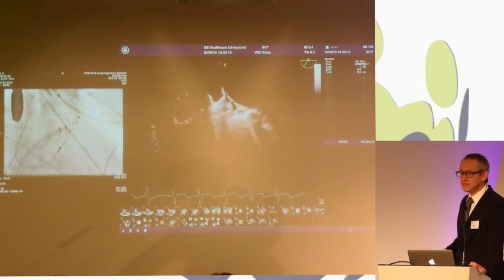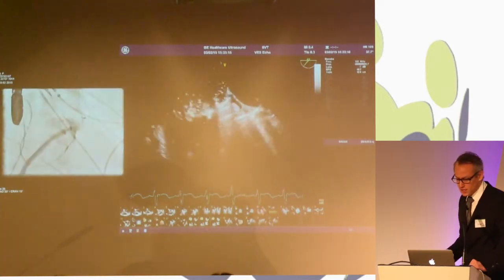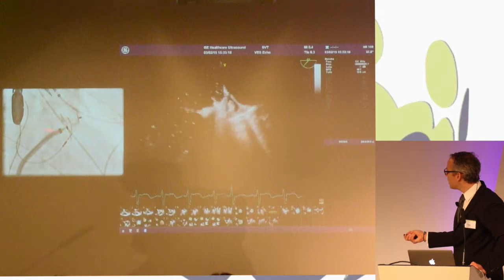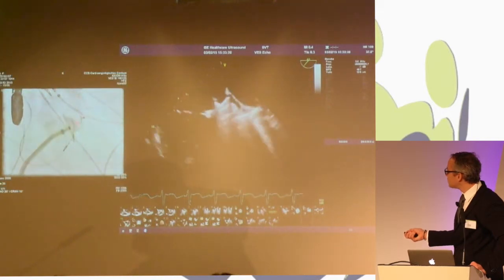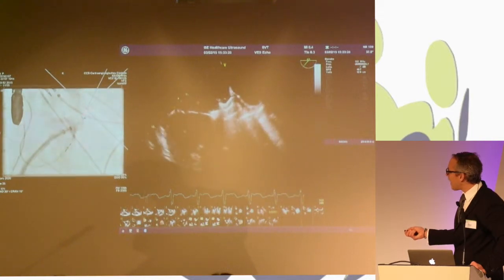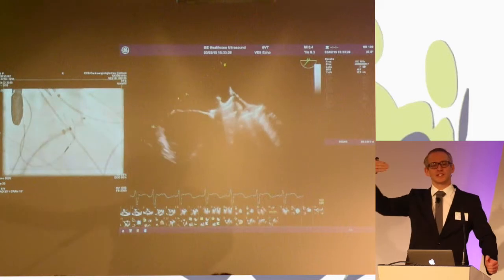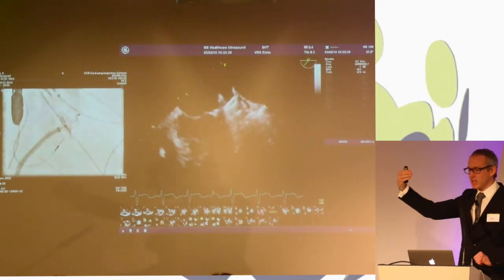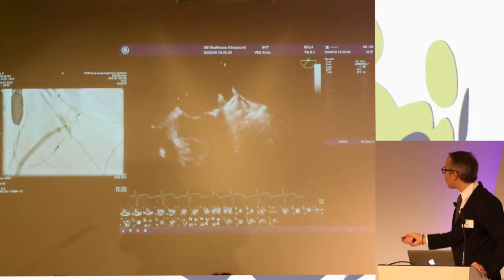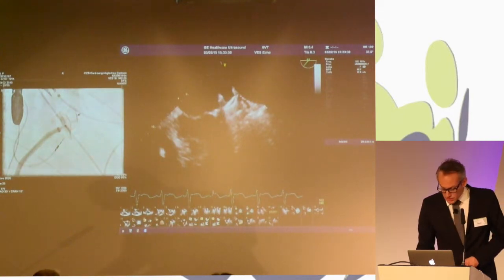If we like the TE position, we start to do an angiographic assessment. This is what you see here. And in this cranial view, you see that the system is really inside, and that the upper part, the cranial part, is probably protruding into this chicken wing lobe going around the corner. That's why it gives this funny shape to you.